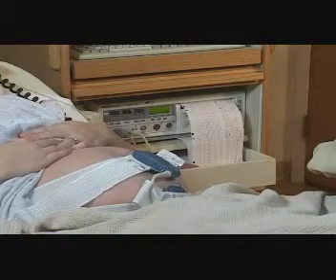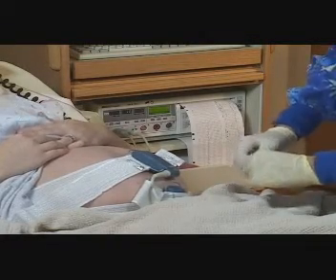Here's a critical thinking exercise related to fetal monitoring. Your client, a gravida 1 para 0, is in active labor. Her cervix is dilated 4 centimeters, and her membranes are intact. The fetal heart rate and uterine contractions are being tracked by an external electronic fetal monitor. You note a baseline fetal heart rate of 110 to 120 beats per minute, and an adequate variability. There are no decelerations, but there is an occasional acceleration up to 135 beats per minute, lasting for 15 seconds.